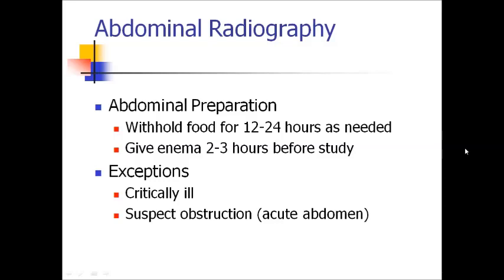Exception is bad condition of patient and suspicion of obstruction, suspicion of acute abdomen. In these cases, of course, abdominal preparation is contraindicated and patient should be taken under X-ray examination immediately without preparation.